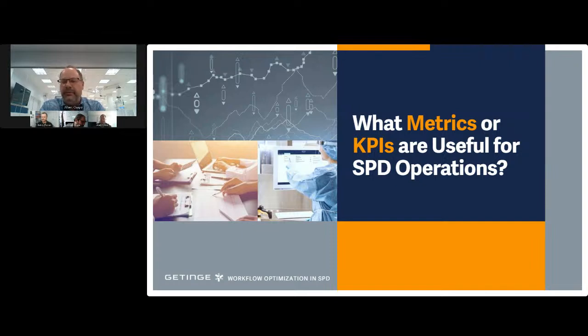If we're turning a set over 3 times a day, then there's a really good indication that we probably need another one, because it's a recipe for disaster. You can use that data to show your finance director, here's proof. Returning the same set over and over again, and all you need is that one set to have an error or an issue, and that case is either postponed or delayed.